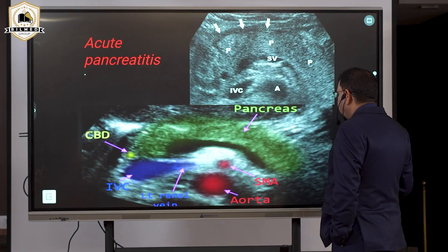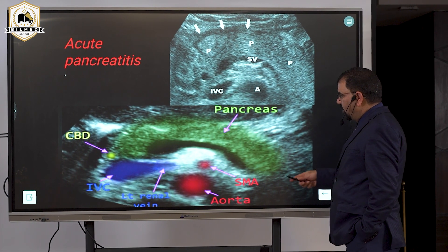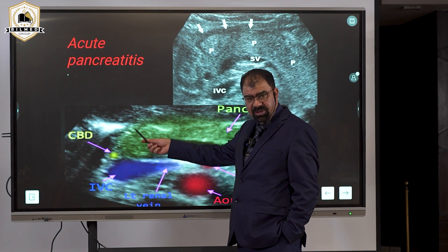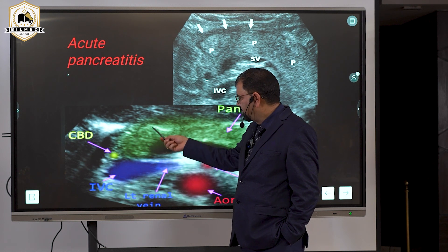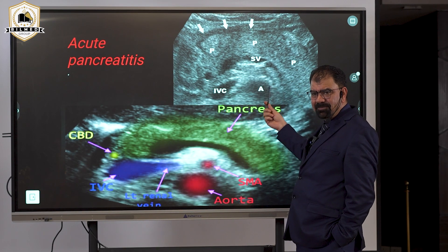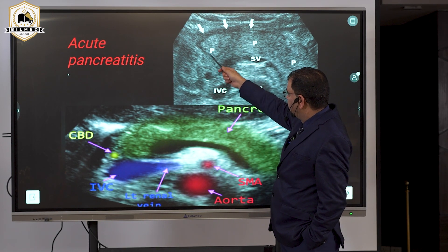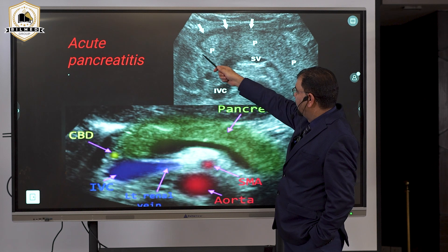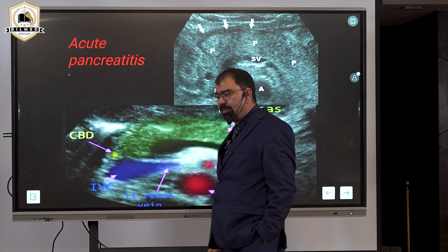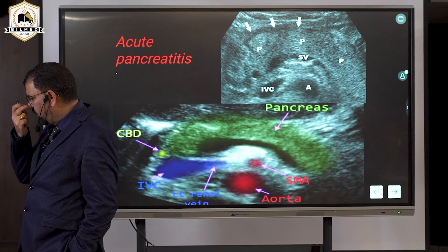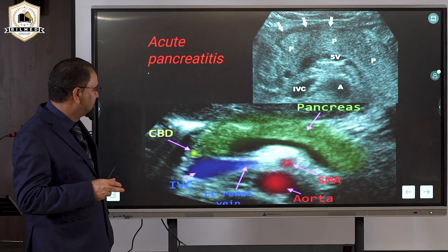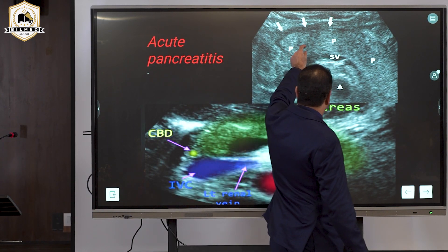Looking at this image, the pancreas measurements are increased — 30, 15, 25, 20 millimeters — all increased. The echogenicity of the liver is almost equal to the echogenicity of the pancreas. This is a hypoechoic and inflamed pancreas, which represents pancreatitis.